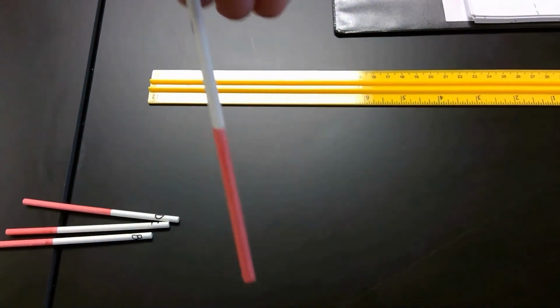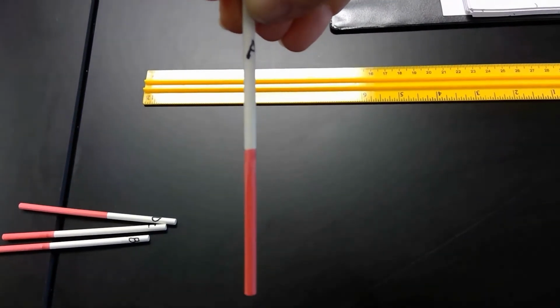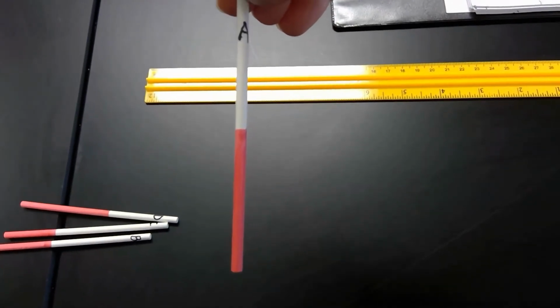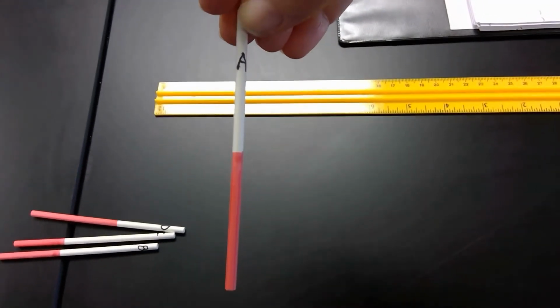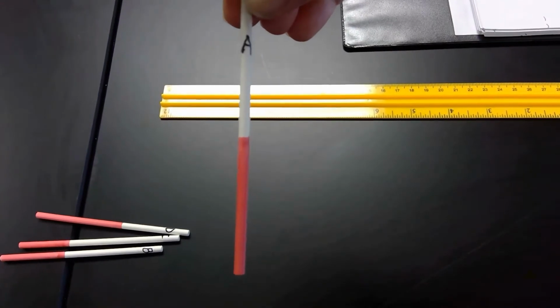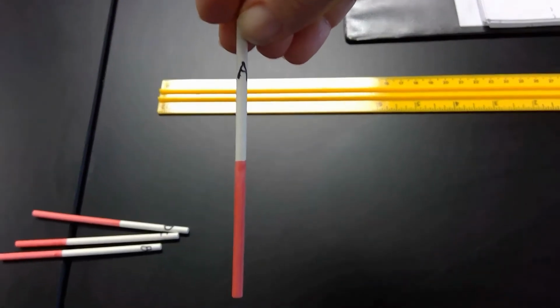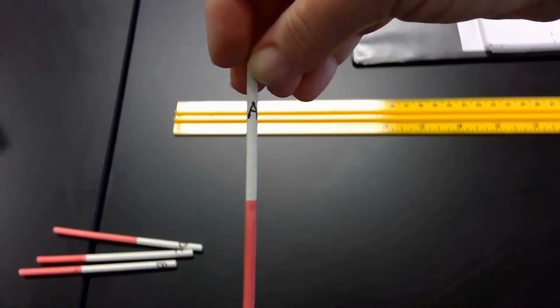And these are just little sucker sticks that I bought in the craft section, and I used a marker to make them look like a hematocrit tube. So in real life, you would have a test tube of blood, you would put it in a centrifuge, and the red blood cells would go to the bottom, the plasma would be at the top. There's pictures in your book of what this looks like in real life.